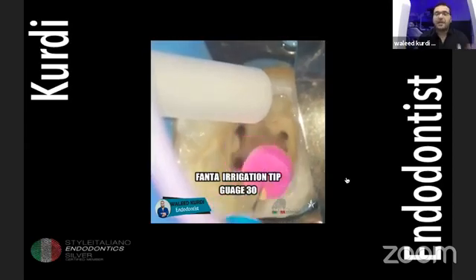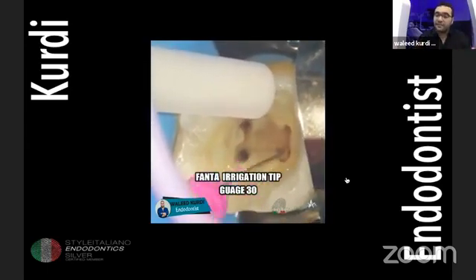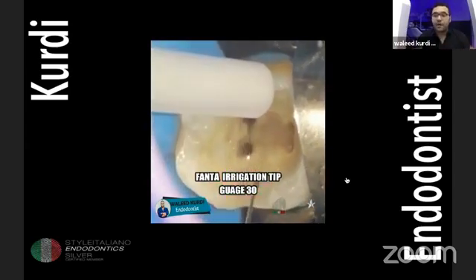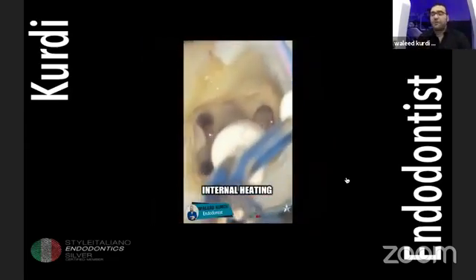And then after that, I start to use Phantom ledge correction file in a reciprocation motion, as I told you, the settings in eConnect S endomotor. That's why I really like this combination. As we said, right tools to have perfect goals. All right.